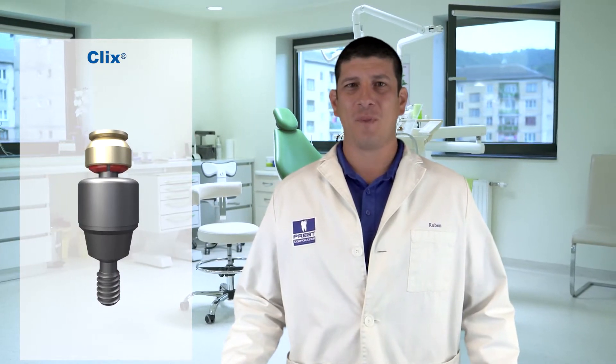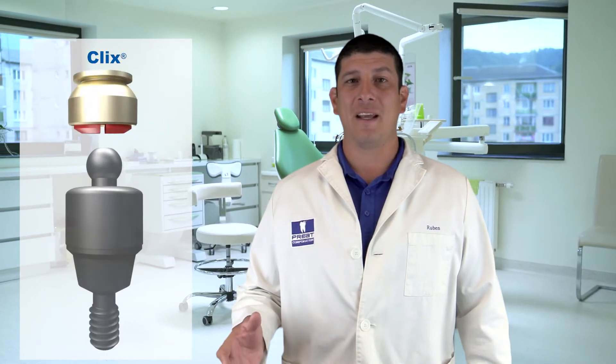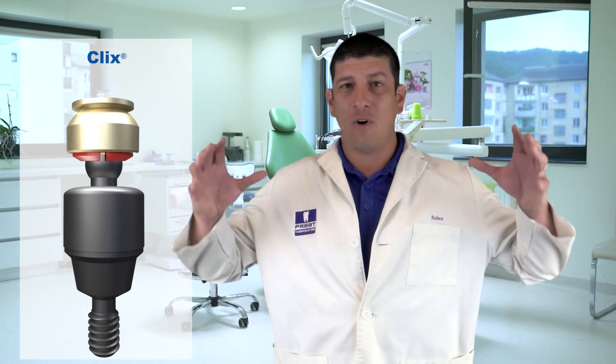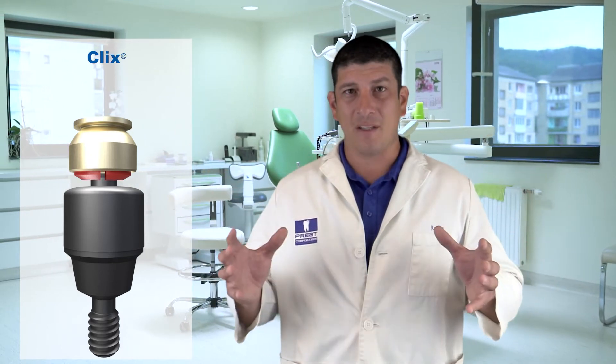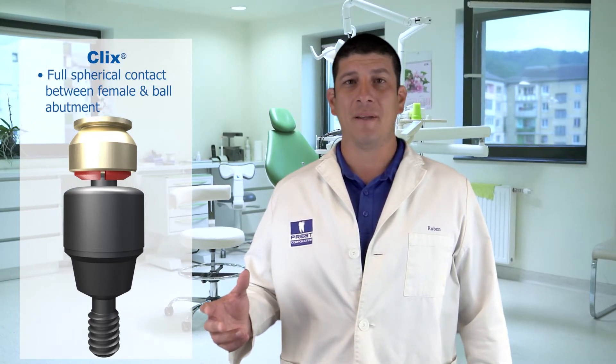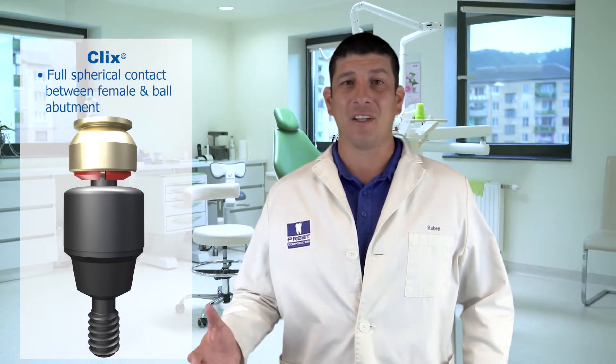The audible click when a patient inserts a prosthesis is all because of the unique design of the Clicks female. The female is sectioned into four sections, which allows the internal design to be a complete negative to the sphere engaging it. As the patient inserts the prosthesis, the female can flex out over the height of contour and then snap into the undercut of the sphere. With that, we have full spherical contact between the female and the ball, providing greater stability and retention.